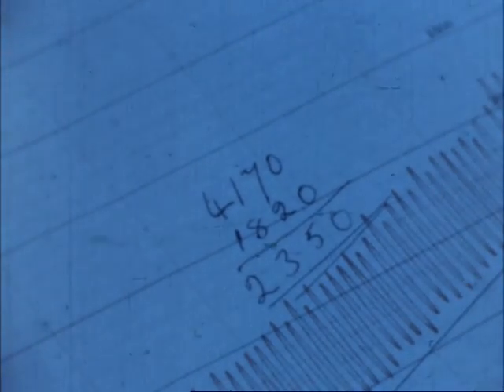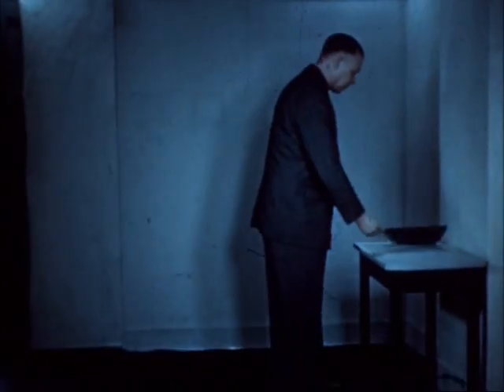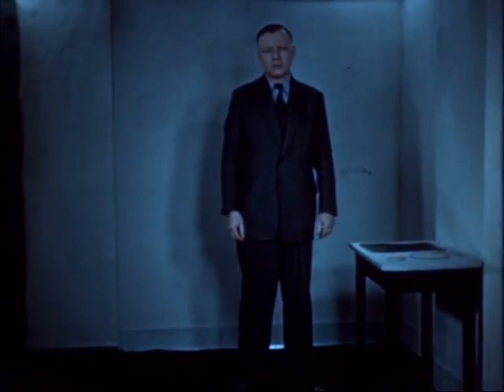We now proceed to sample mixed venous blood. Werner Forssmann, responsible for developing the technique of direct sampling of blood from the right side of the heart: "In the summer of 1929, I conceived the idea that a thin, flexible ureteric catheter could be inserted along the veins into the heart without harm. In the Augusta Victoria Hospital at Eberswalde, near Berlin, I myself exposed a vein at my left elbow and inserted this small catheter."